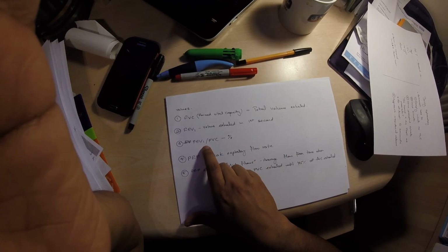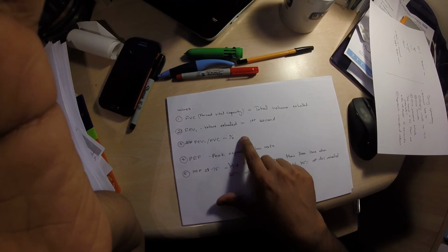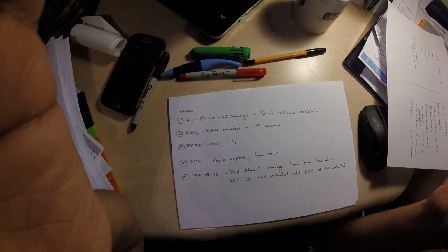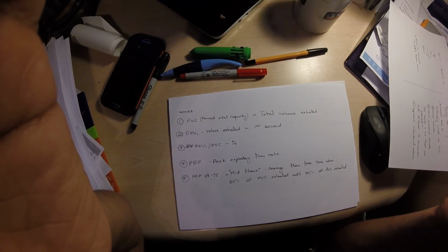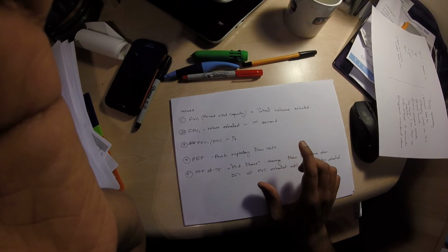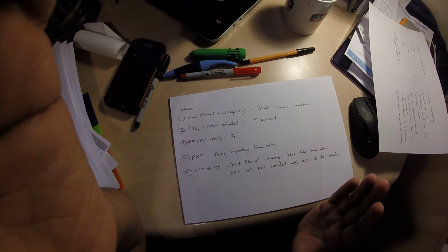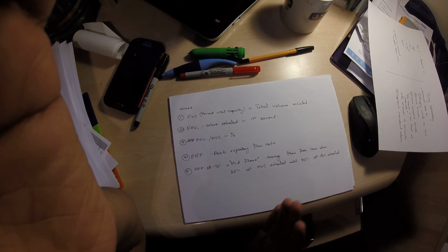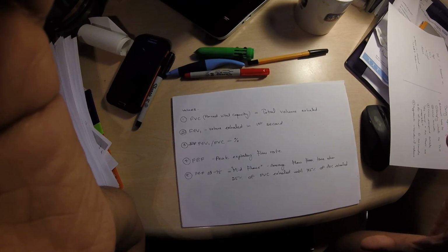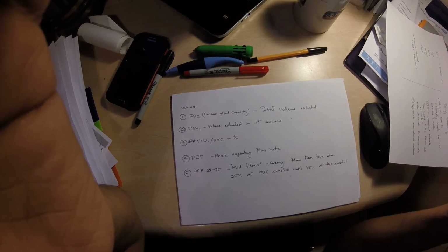The FEV1 over FVC ratio will give us an indication on the type of lung disease, a restrictive or obstructive picture. The peak expiratory flow rate is calculated on the slope of the curve that they get, and that helps decide how many liters of air they can push in 1 second.